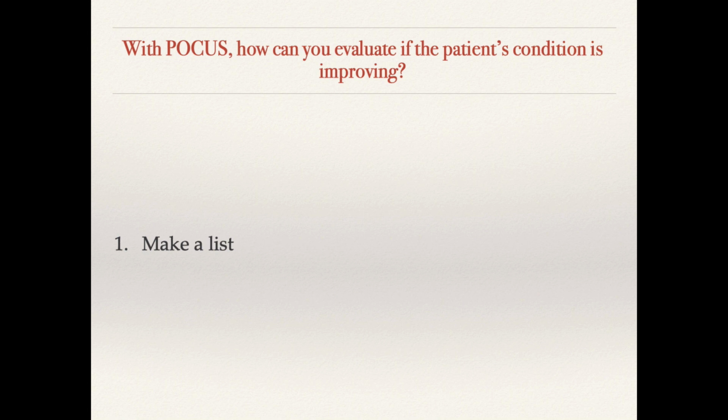So if we see the B lines resolving over time with ultrasound, that is a sign that the patient is getting better. They've done studies looking at patients pre and post dialysis, so pre and post volume overload, and they can see B lines present before dialysis and then resolution of those after dialysis. So it makes sense that we could do this with a congestive heart failure patient and pulmonary edema.